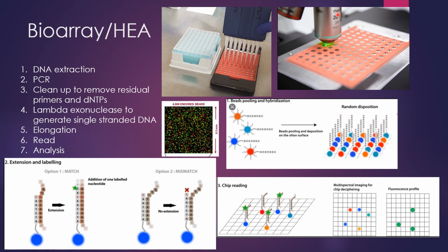And then you take a picture with a fluorescent microscope, and you get an image that looks like this, which we cannot decode. It's so teeny tiny. There's a software that will basically know what each SNP is at each location, and then it will give you a phenotype.